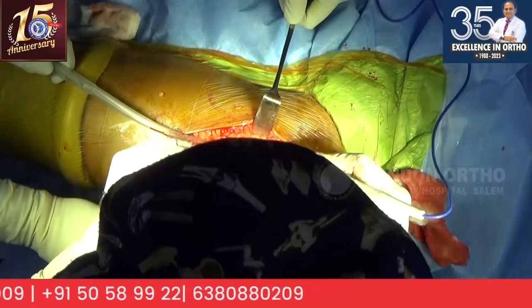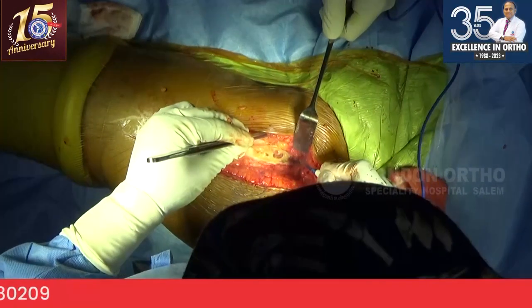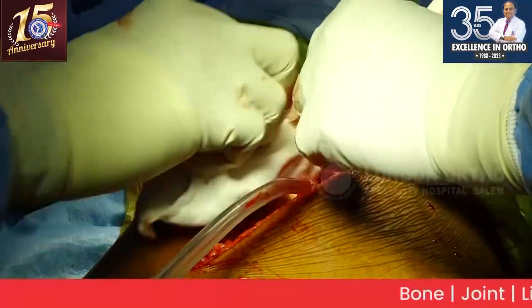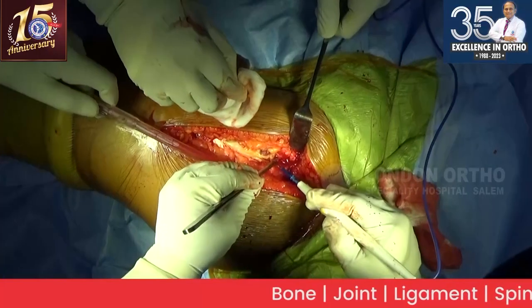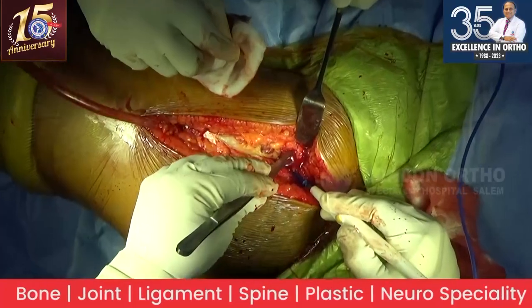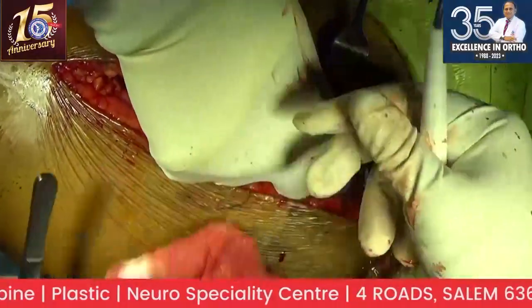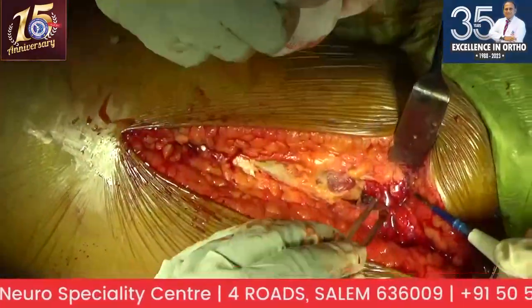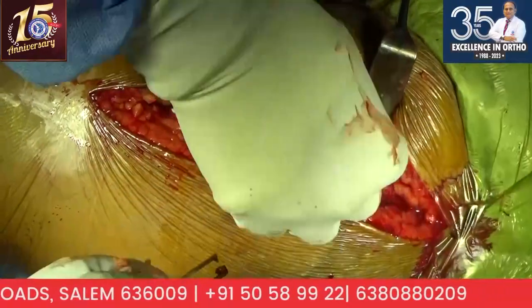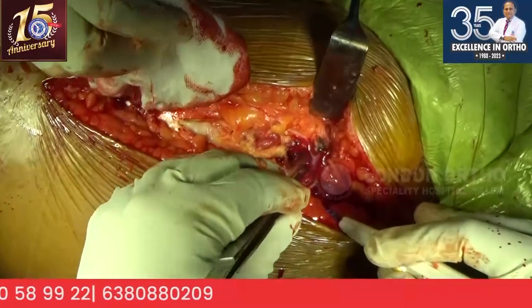So this is the case Vignesh discussed in the X-ray templating. This coxa vara is 124 degrees, the opposite hip. Most probably we will be using a low offset cemented stem on the femoral side. So most of the concentration for this discussion is going to be on the acetabulum side, and achieving the length, how you are going to bring it down. That's right.